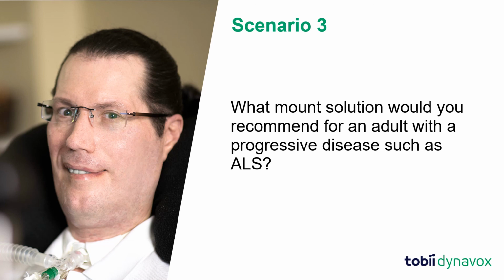Another question might be, what is the access method? Touch or eye gaze? For this client, the access method in the early stages of the disease may be touch, but we want to consider a transition to eye gaze. Another question might be, what stage of the progression is the client in?